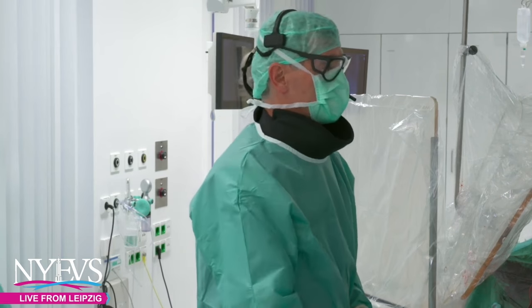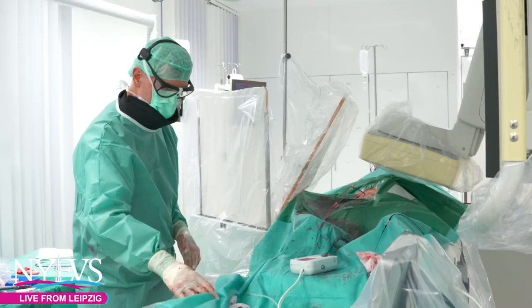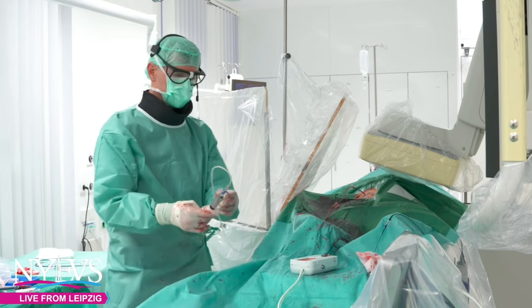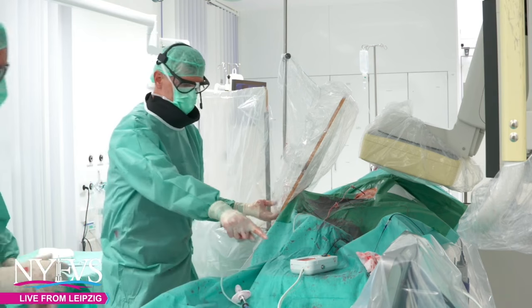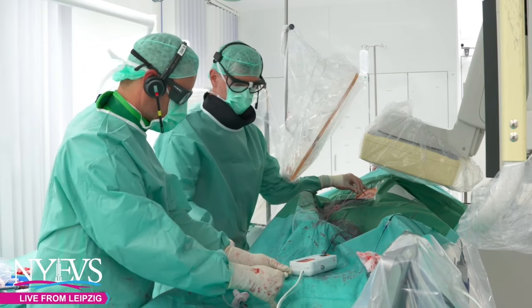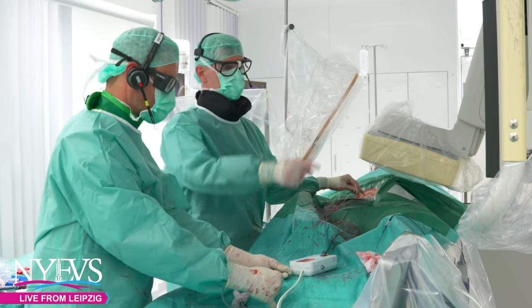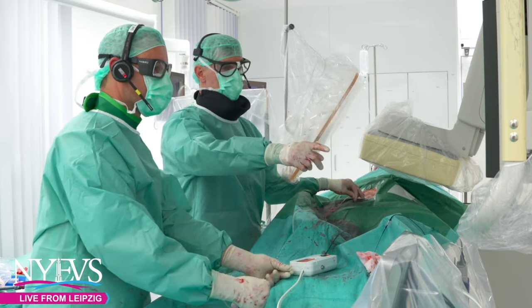Thank you, Andre. Another great case. Maybe we can go down the panel real quick. Liz is coming from University of Pennsylvania, assistant professor of vascular surgery. How would you approach this case in your practice, Liz? Would you look at this as a primarily endo case, or would you look more to a surgical option in this case, given the CTOs you're dealing with?